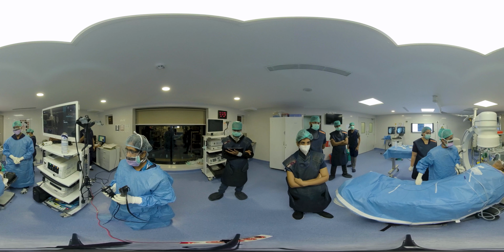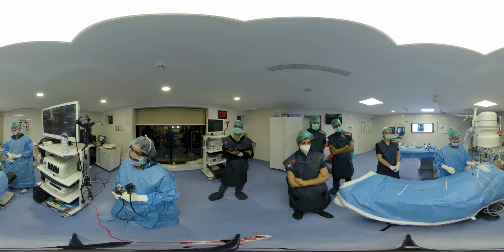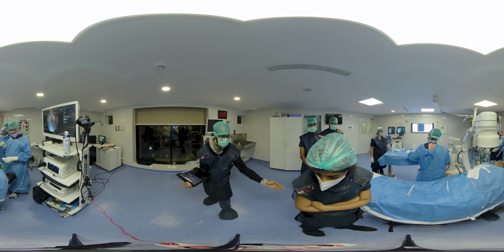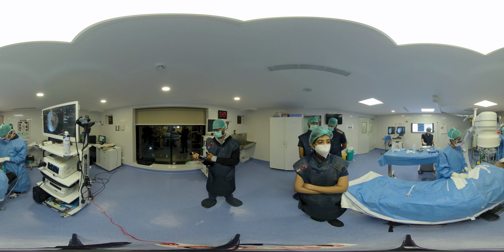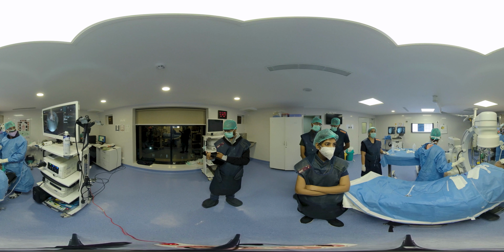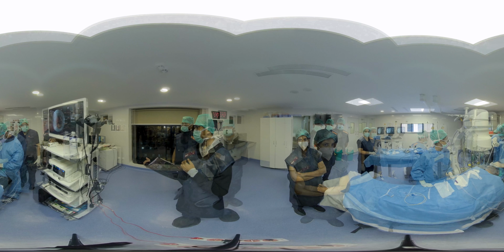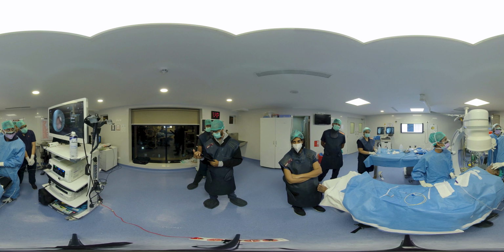So now we will go in for a rigid bronchoscopic intubation. We generally choose a 12 or a 14 size rigid barrel. Now you will be seeing the rigid bronchoscopic intubation being done with the modified technique. Now you can see that we are using the modified non-telescopic rigid intubation. I am covering the incisors with the help of a gauze, and I am pushing the base of the tongue outward. We are pushing the tongue out.